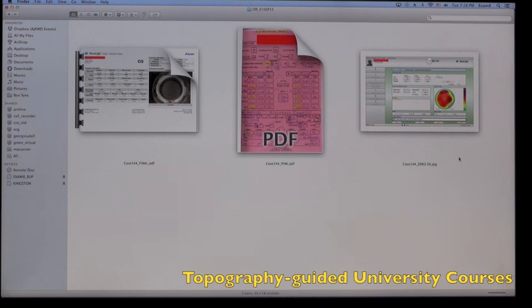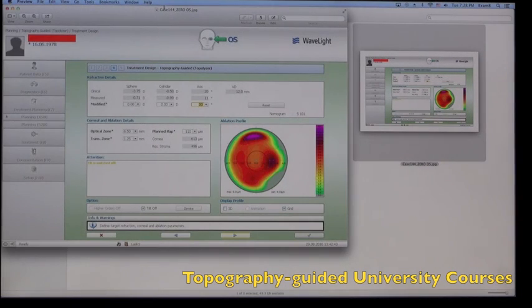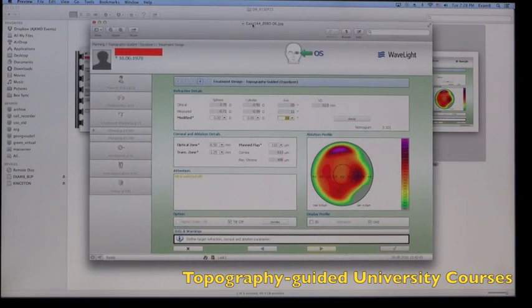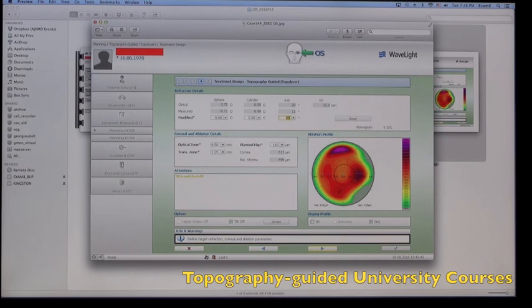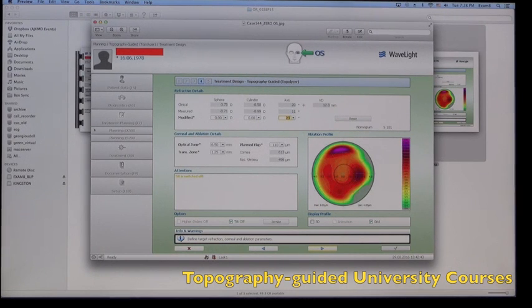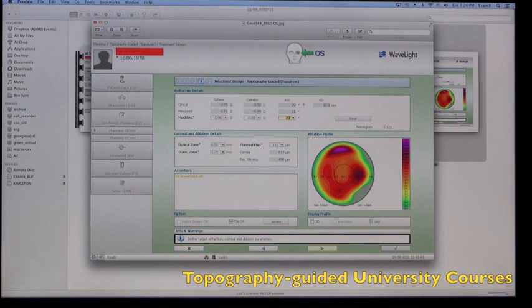So on that platform, you can see on the top part of the measurements is the clinical measurement, and this is the actual clinical refraction which for us is a mixture between the dry and the wet manifest.